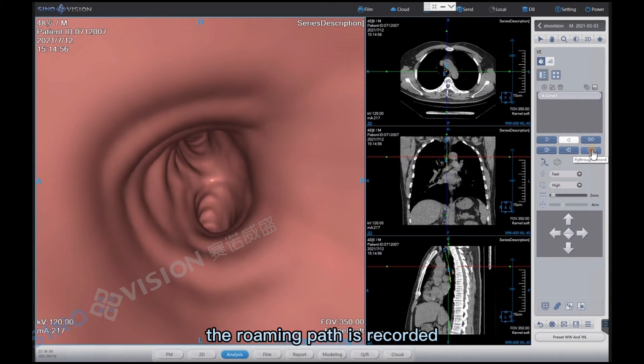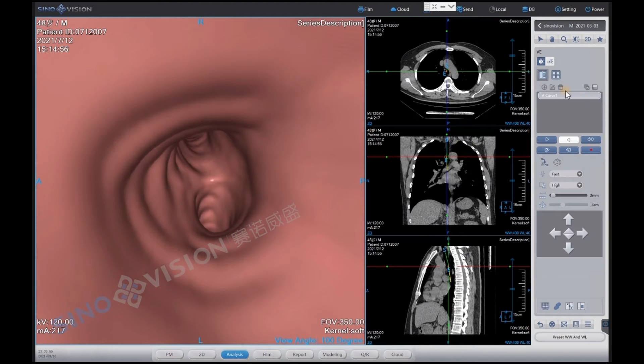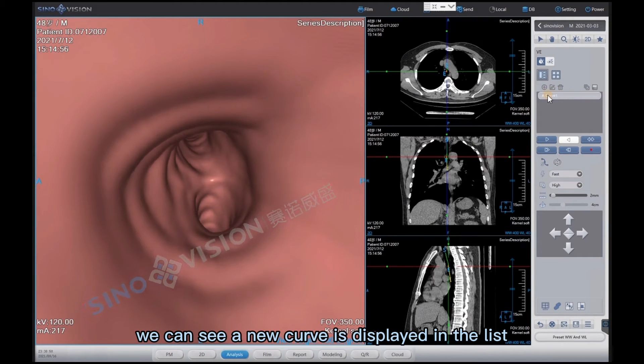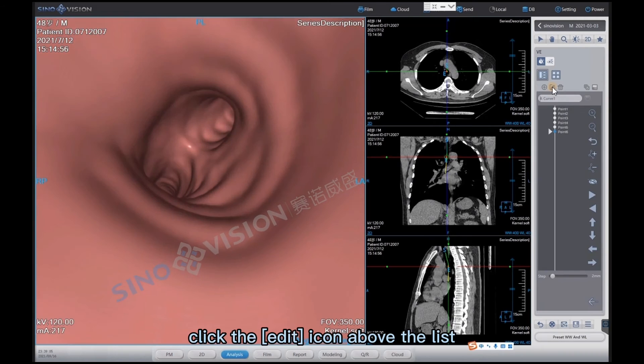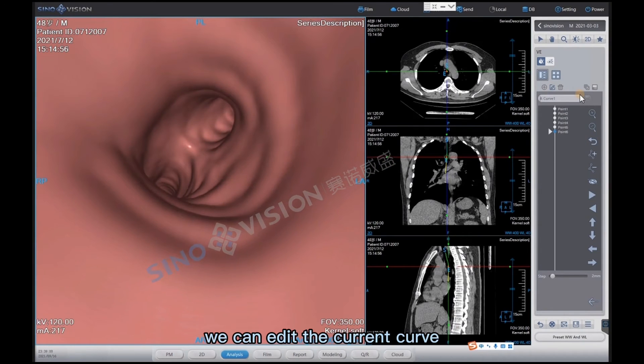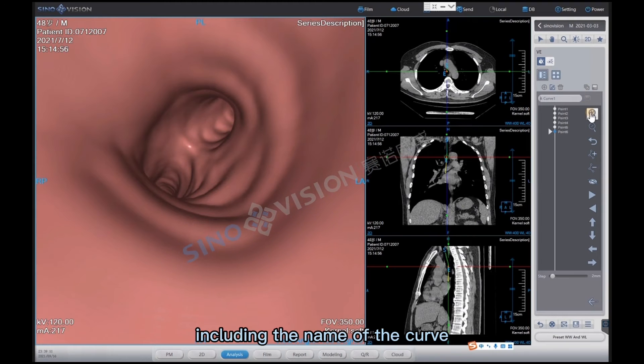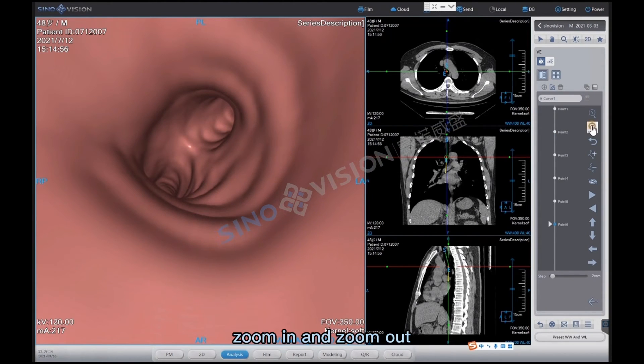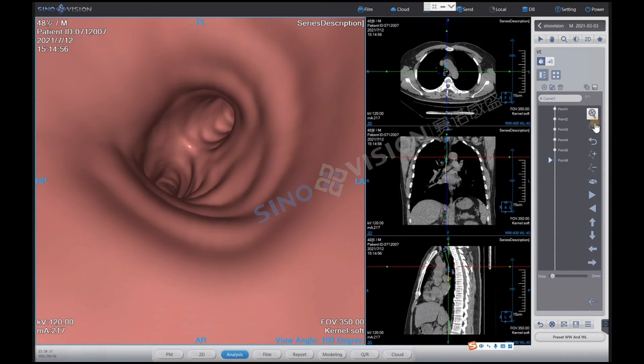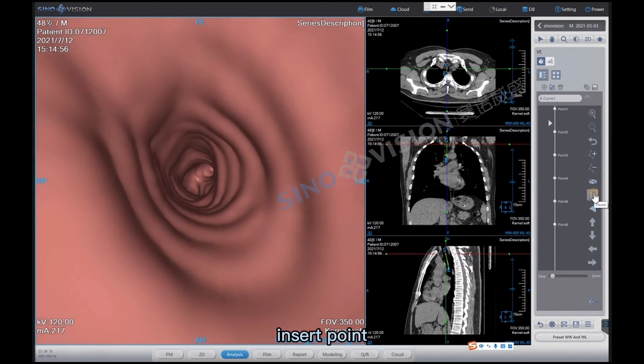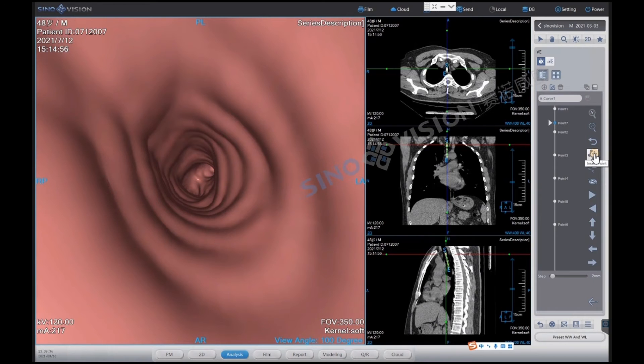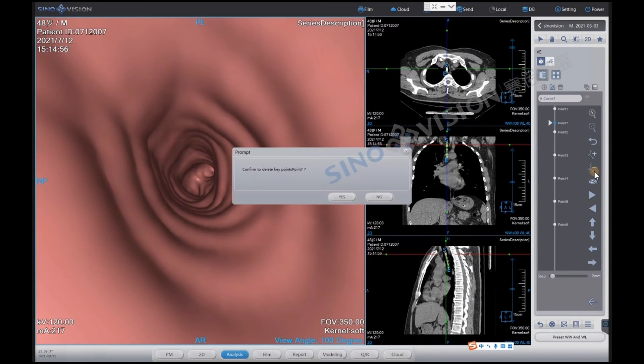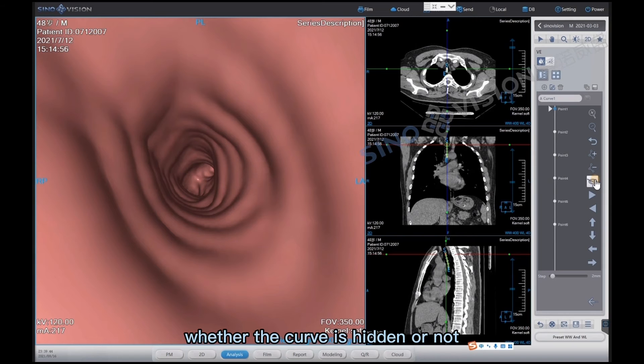The roaming path is recorded. We can see a new curve is displayed in the list. Click the edit icon above the list. We can edit the current curve, including the name of the curve, zoom in and zoom out, reset, insert point, delete point, whether the curve is hidden or not.